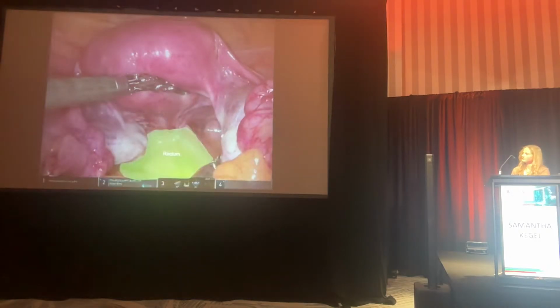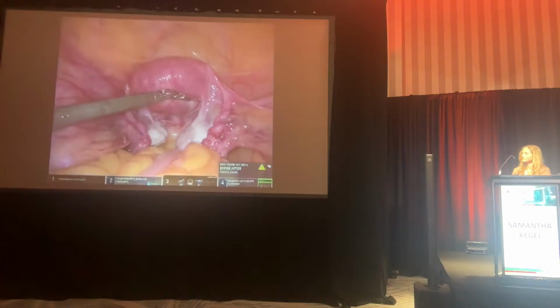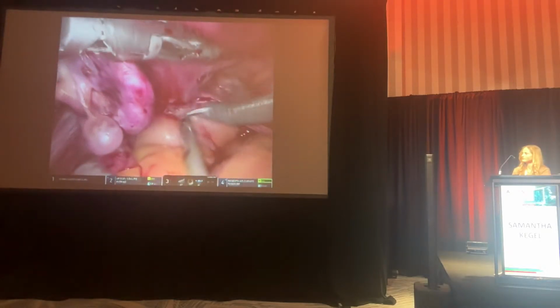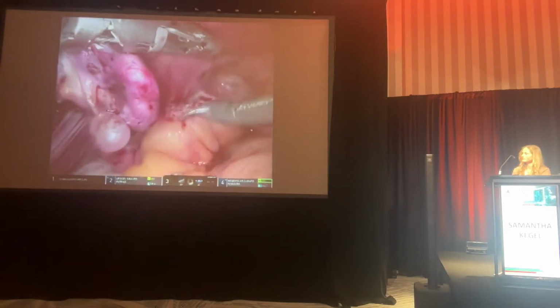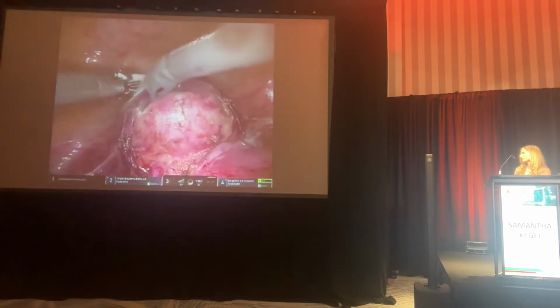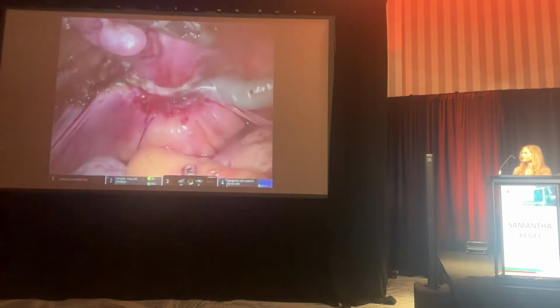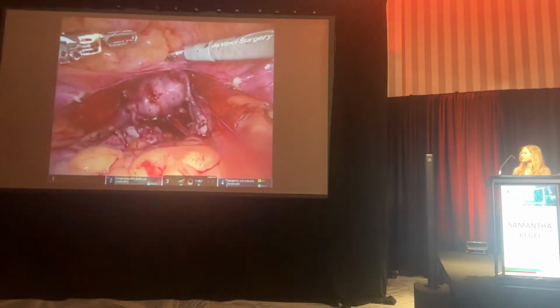Upon abdominal entry, a normal-appearing 8-week sized uterus was noted with dense adhesions to the bladder and rectum. The posterior cul-de-sac was obliterated, with thickening of the uterosacral ligaments. A 4-centimeter friable glandular vaginal lesion was noted arising from the posterior fornix of the vagina. Ureteral stents were placed to ensure visualization of bilateral ureters. After completion of the superior portion of the hysterectomy, colpotomy was performed with care taken to avoid the vaginal endometriosis and the rectum. The specimen was removed vaginally.